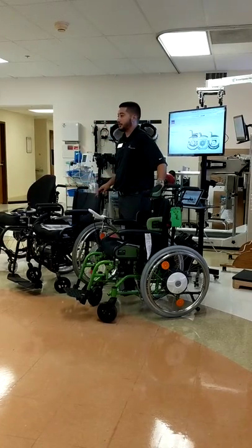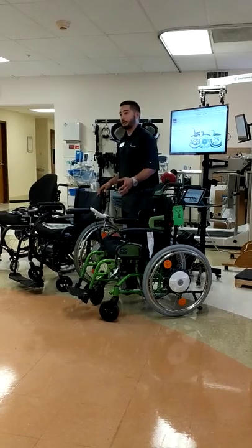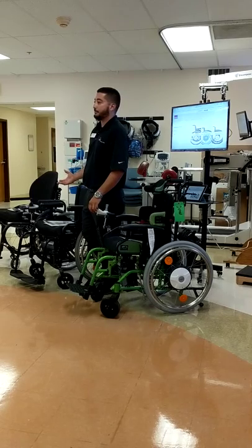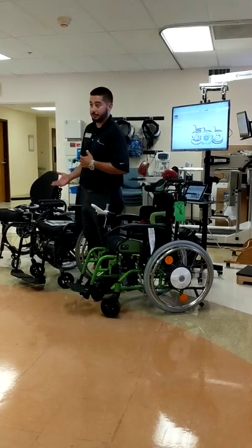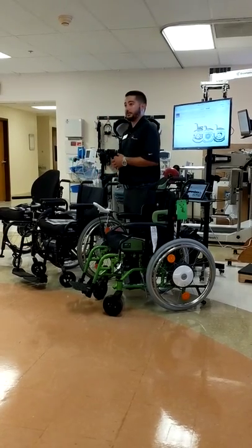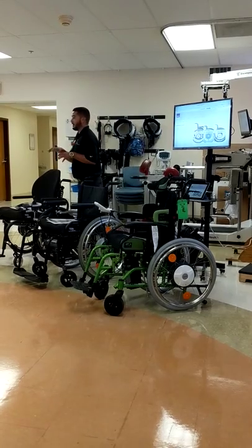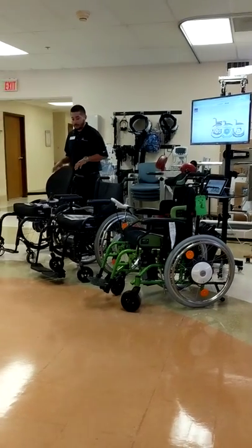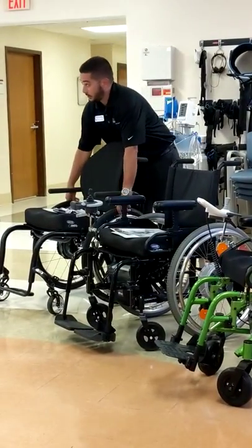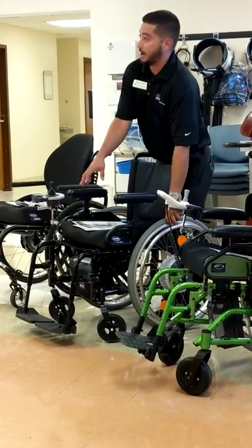We brought two separate demos to show you today on eFix. We have the E35, which is the newer version that runs off of a lithium battery, and then we have the E25, that is the older version of the two, runs off of a little bit of a bigger battery. We also have power assist, which is Twion. The products that you're looking at are just the wheels, joystick, and battery pack.